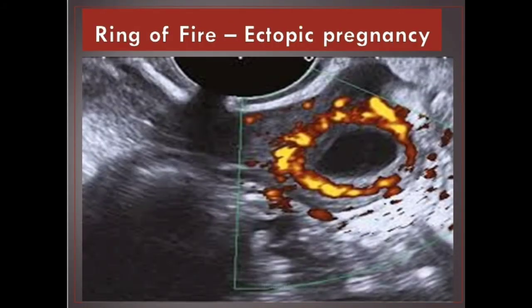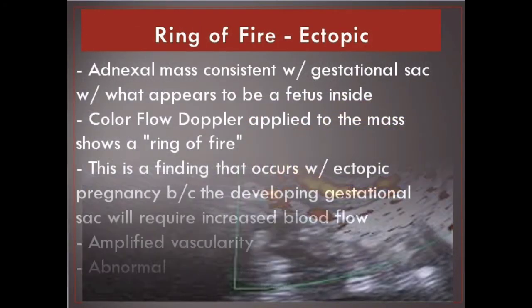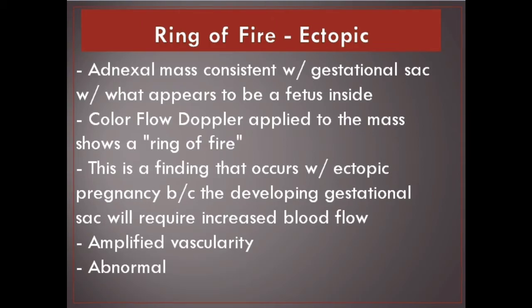Ring of fire. Ectopic pregnancy — adnexal mass consistent with a gestational sac which appears to have a fetus inside. Color flow Doppler applied to the mass shows a ring of fire. This occurs with ectopic pregnancy because the developing gestational sac requires increased blood flow, resulting in amplified vascularity. Abnormal.